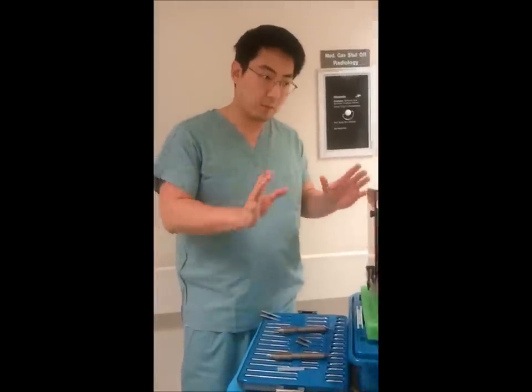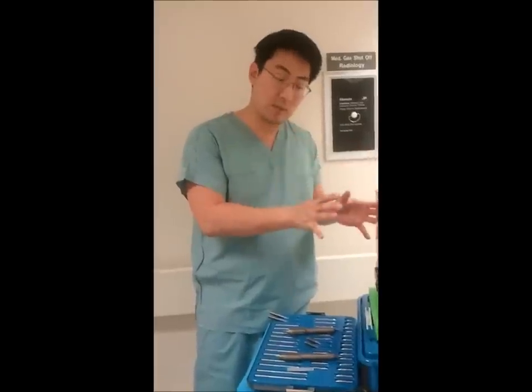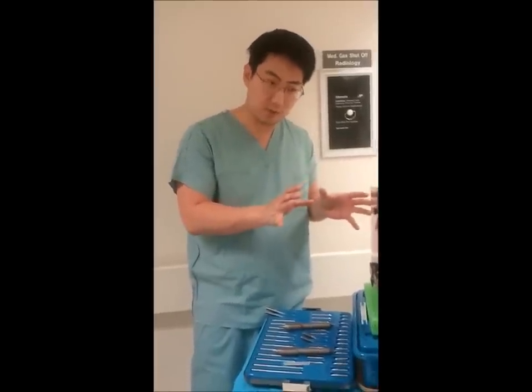I'm Ed from Dallas, Texas. We're going to review placing the screw fixation pins onto a practice plastic skull with the Lexel frame system.